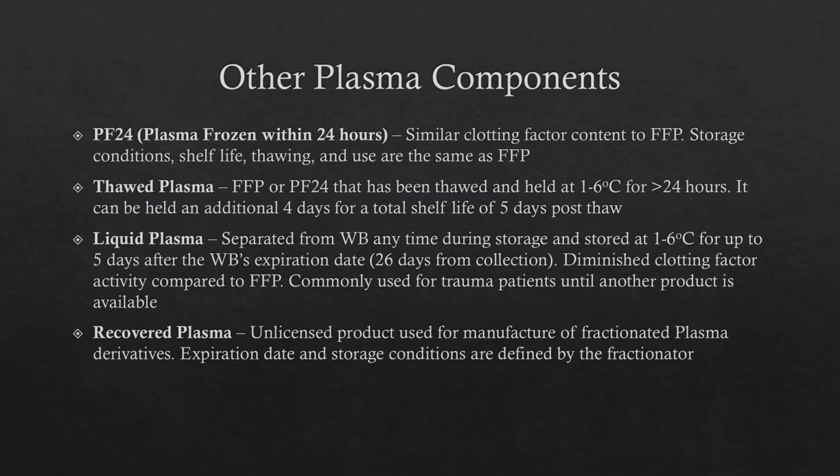So whole blood can only separate it with the anticoagulant preservative, this is not an additive solution bag. This is a whole blood that would have had a 21-day expiration date.